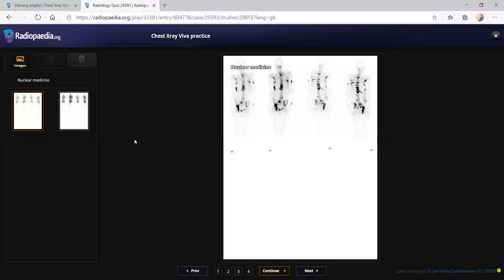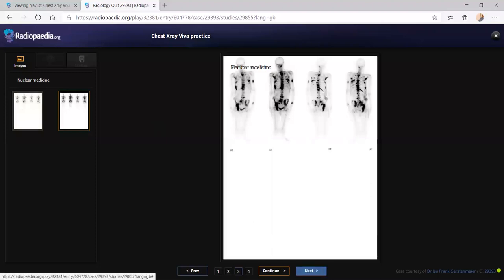Yes, so the bone scan is showing multiple areas of high uptake noted within the spine, as well as the peripheral bones, the humerus, as well as the ribs and the right iliac bone, the hip joints. So these are multiple bony metastatic processes, likely attributed to prostate cancer. What is his appearance called? So this is a super scan because I'm not able to see the renal shadows. Okay. A metastatic super scan.